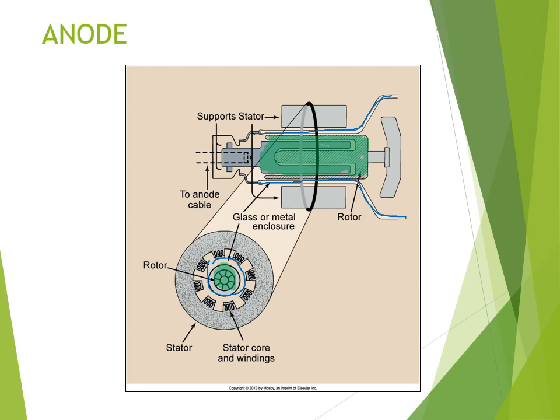And then outside that are going to be the stators. So they're up here. There's only two shown from the 2D perspective, and when they turned it on end, we can see the true number of them. So there you go, we have a total of 8 of them. And as I said before, electricity is brought to the stators, which causes the rotor to spin. It's called an induction motor because there are no touching parts.